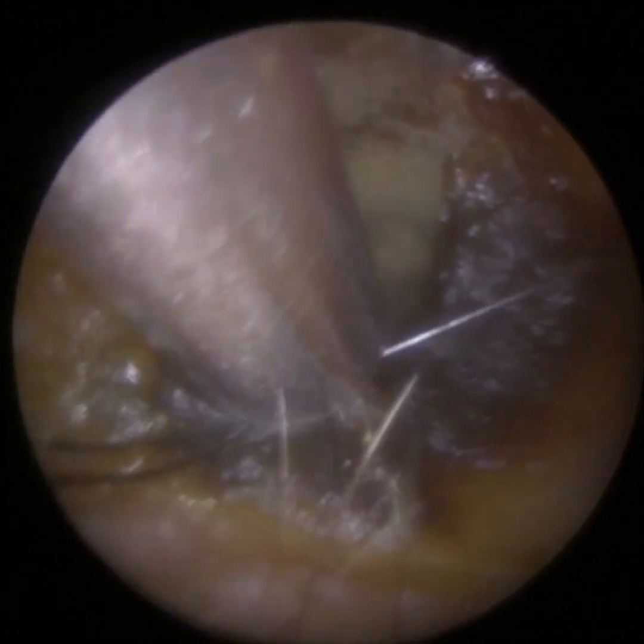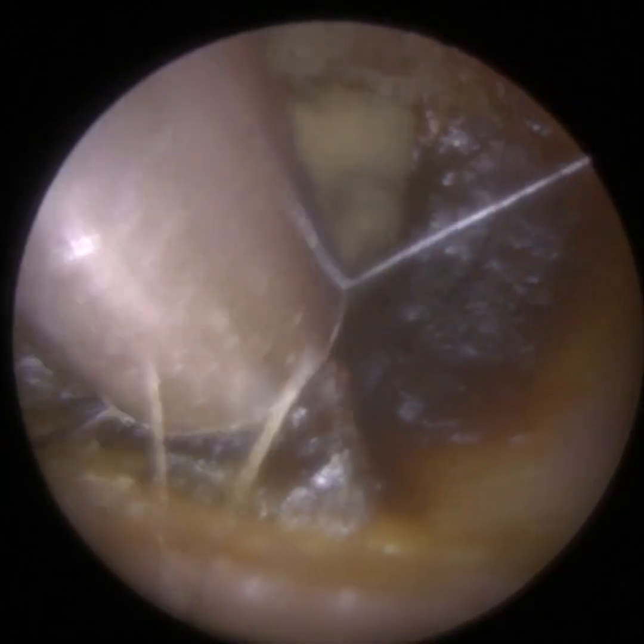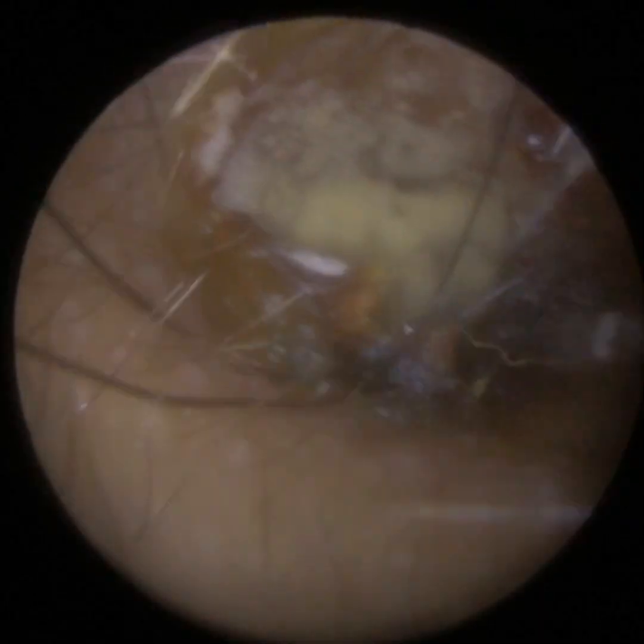So we're back to the patient's left ear. This is the main procedure. This is what the patient came in for, should I say. There is a bit of wax there as well. You can see there's wax at the base. Now, the wax had been pushed in with a cotton ball.